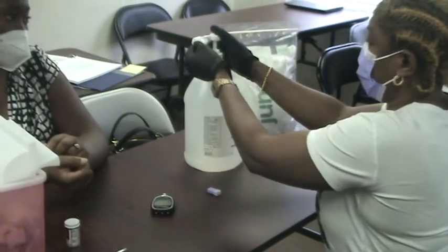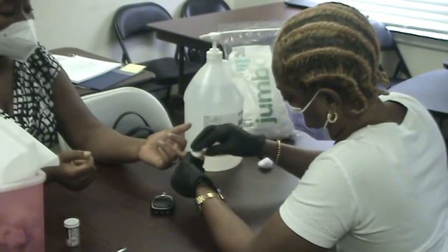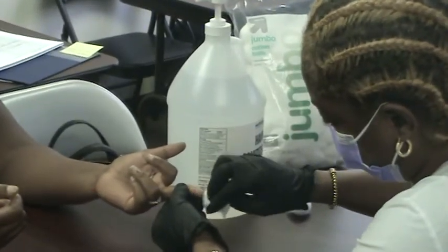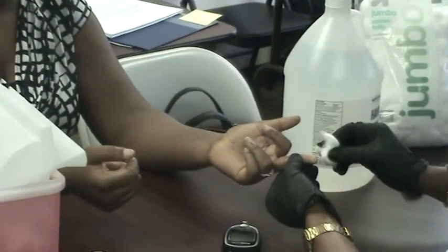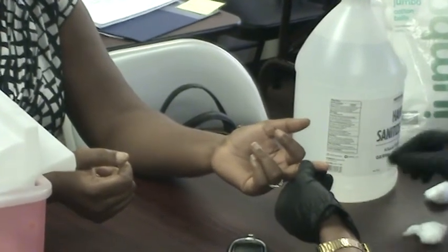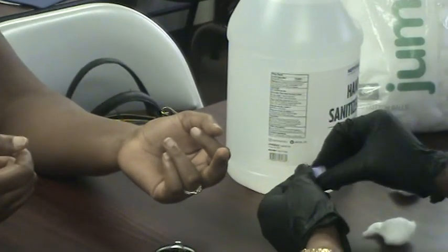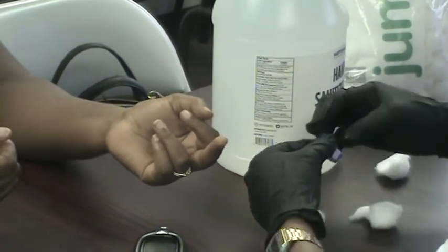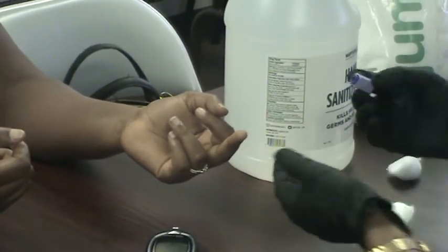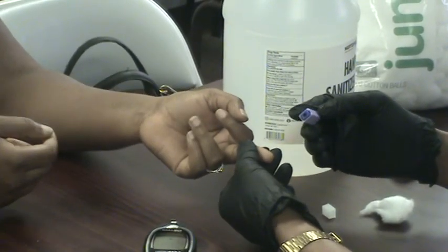Yeah, a little bit. On the edge, the side of the finger, because the middle is too thick to get. That's fine, just let it dry. You were shaking. I was shaking. Why? I'm scared of infection. But you let me decide. Yeah, the side.